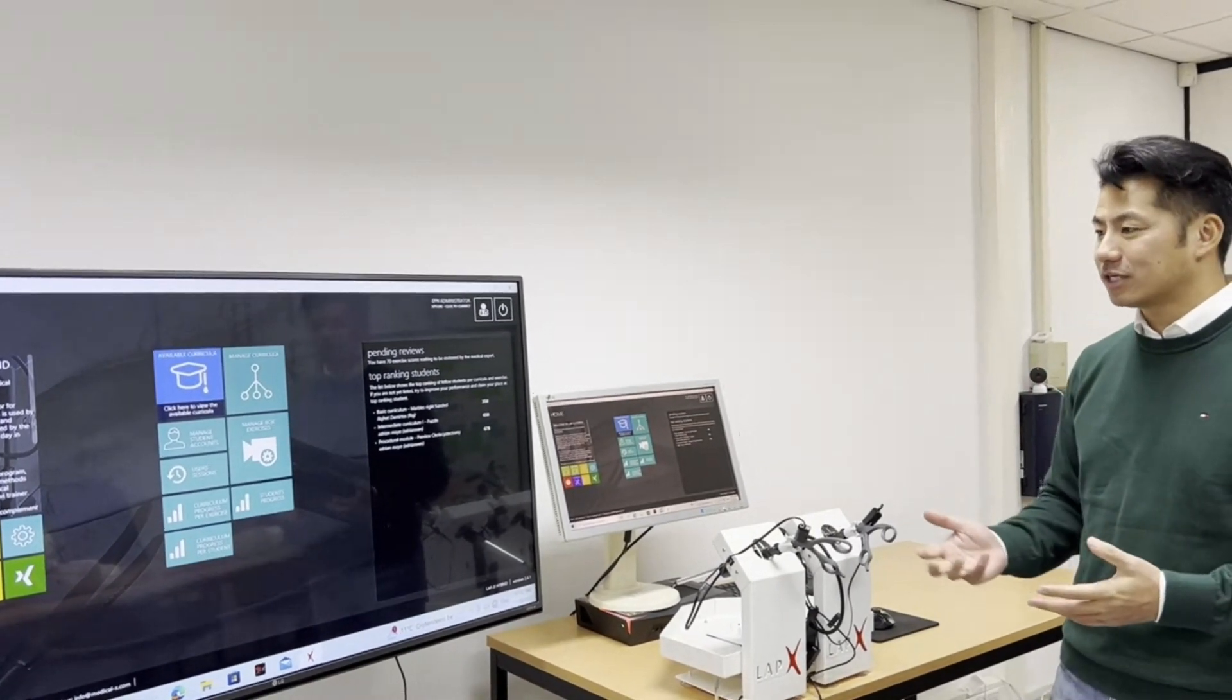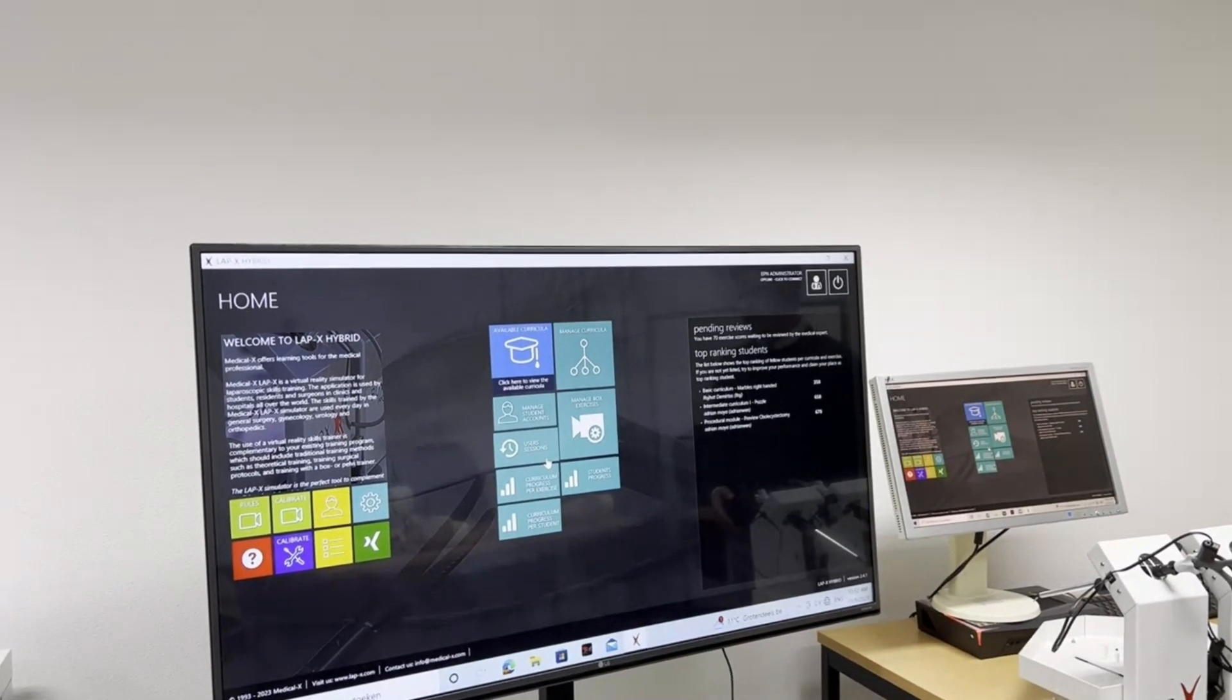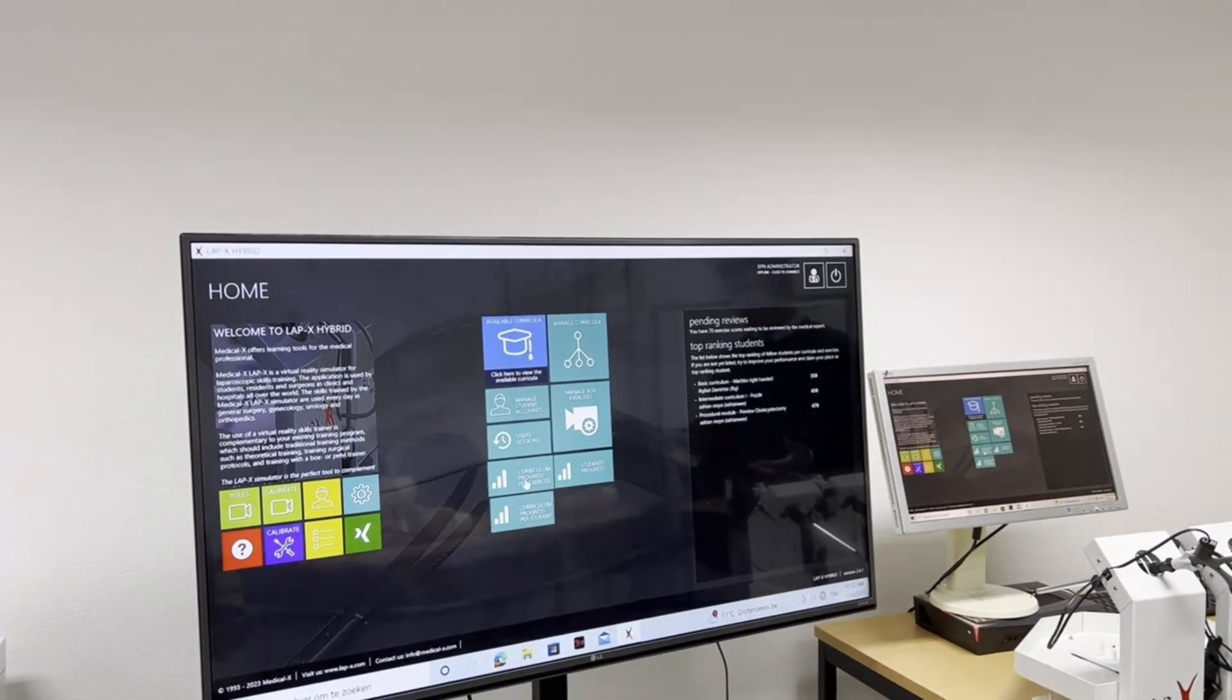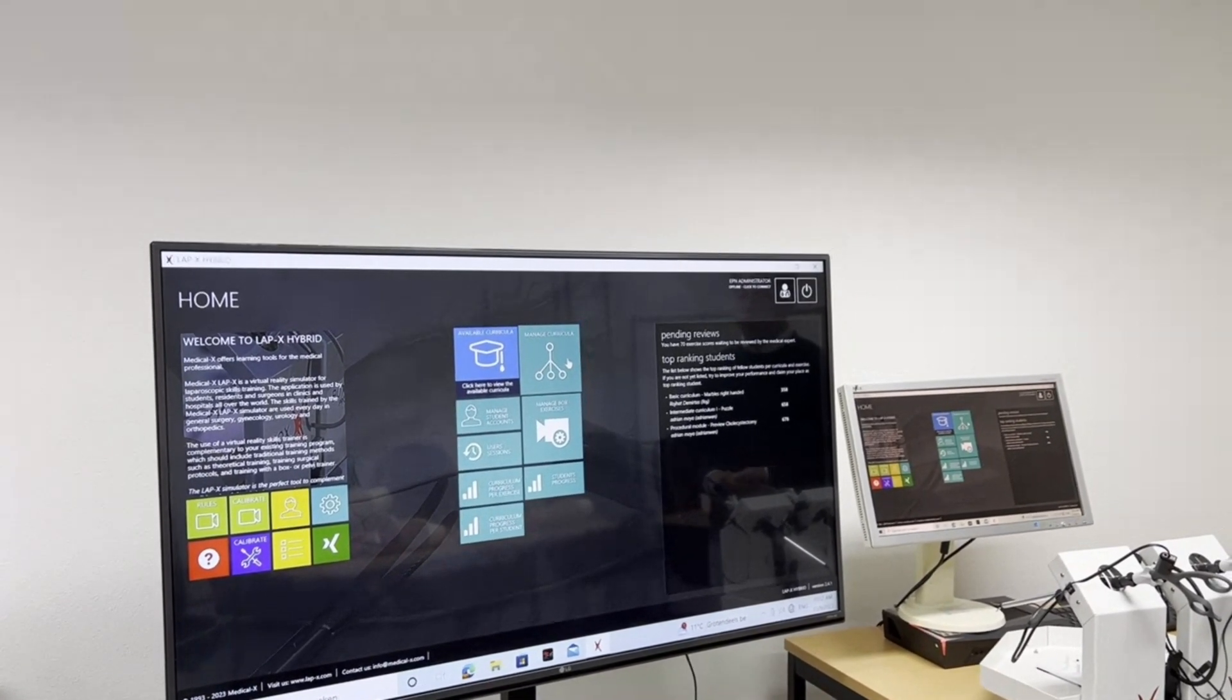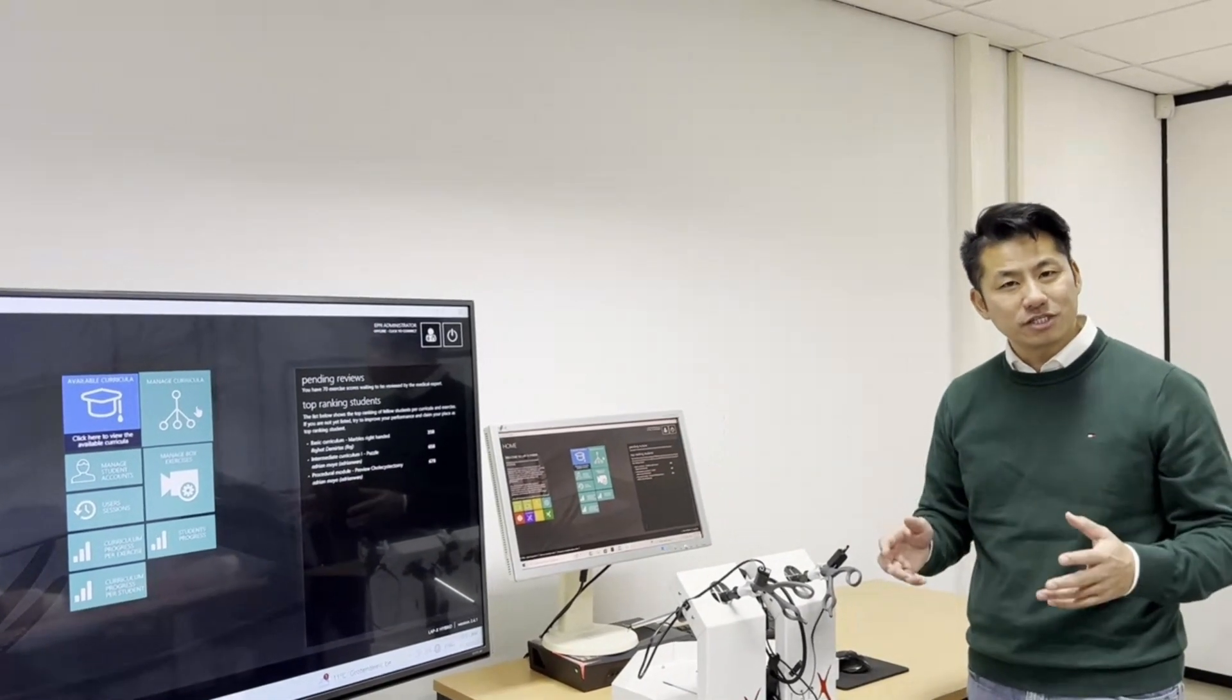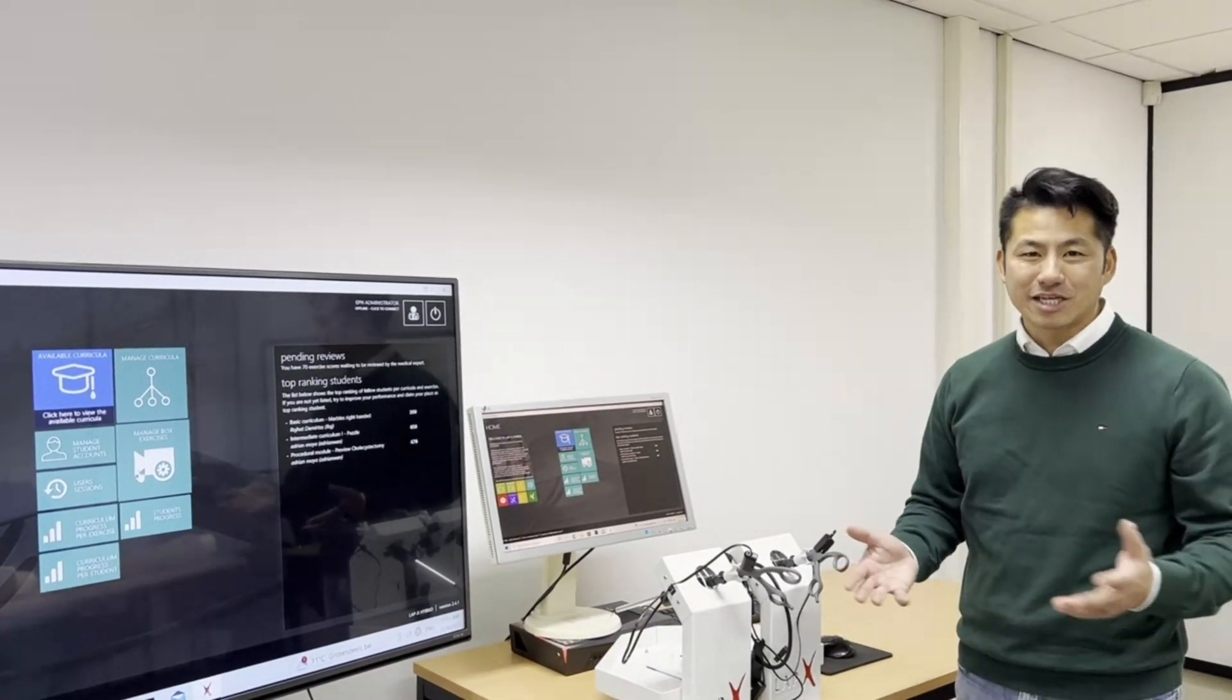As an instructor you have some extra functionalities as well. You can see here a managed student account. Here you can create student accounts. And then we have user sessions where you can see how long the students have trained and how often they have trained. And then here we have some extra progress features where you can see the progress of each student per exercise or see the progress of each student. And you can see the individual student progresses. In managed curricula is where you can create your own curriculum. Like I said before we have 30 plus virtual reality exercises. Box training exercise you can create as many as you want. And with managed curricula you can create your own customized curriculum. So for example maybe you have a curriculum for the first year students. You can make that for yourself. And then finally we have the managed box exercise. And here you can create your own box exercises.